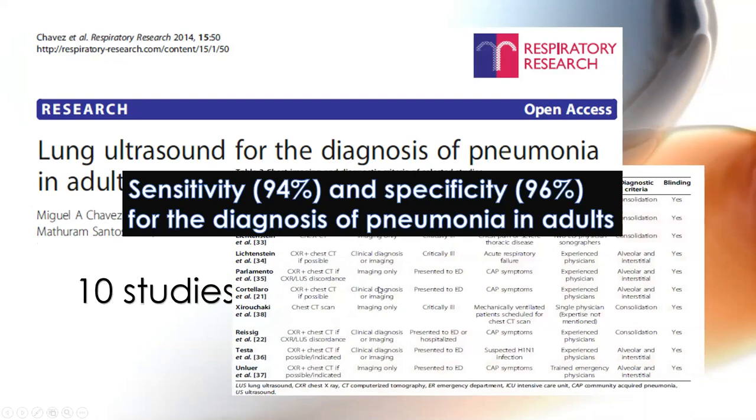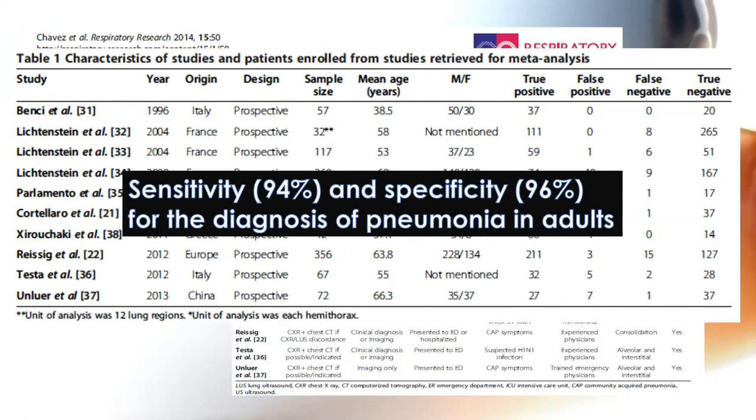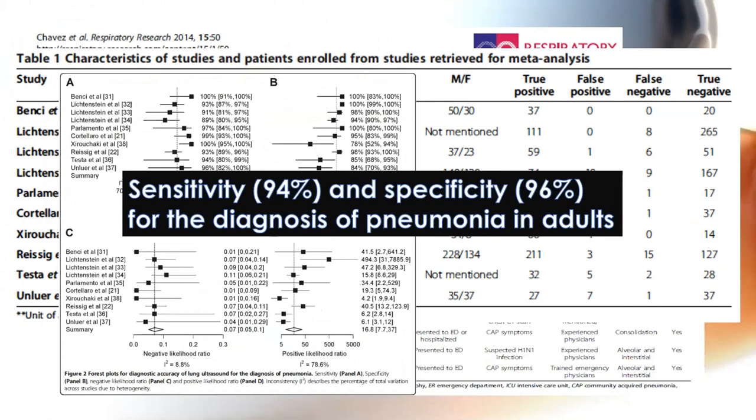And we prove it by CT. So CT is the gold standard. Yes, if you can get them to CT, it's wonderful. Life is good. But nobody wants to take a trip to CT if you don't have to, right? Especially these intubated critically ill folks. Or if they can't lay flat and they're not vented, you're like, I just don't think this is a good idea. Let's just throw a probe on them.